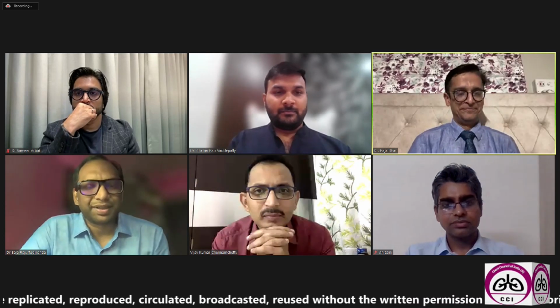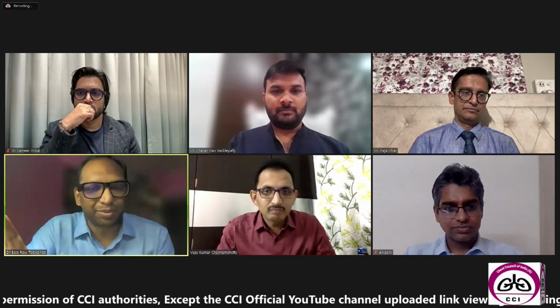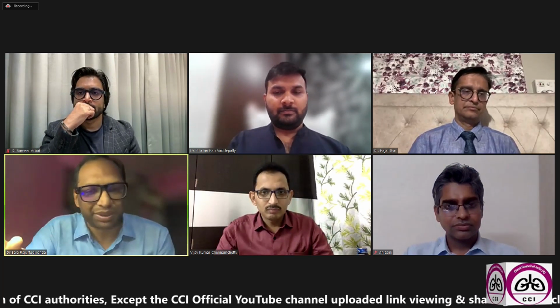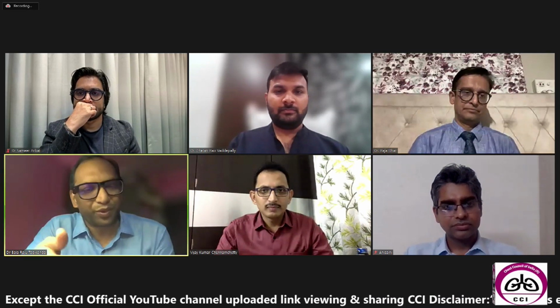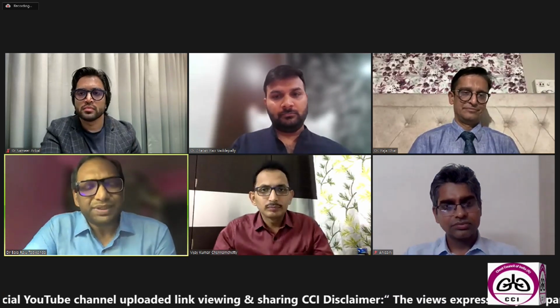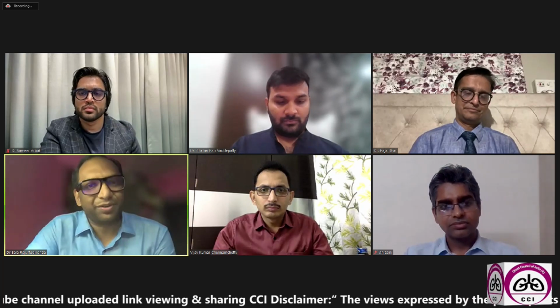And to you, Bala. I second what Dr. Anirudh has said: for me, safety is the priority. I feel that everybody should have that same dictum. Safety comes first before anything else. You plan the procedure, you select your patient, whether he requires a biopsy or not. I'm especially talking about diffuse parenchymal lung disease, the cryo lung biopsy, because in the rest of the cases you have already decided what you want to do, whether debulking or a mucus plug. First is the safety, and you choose your patient.